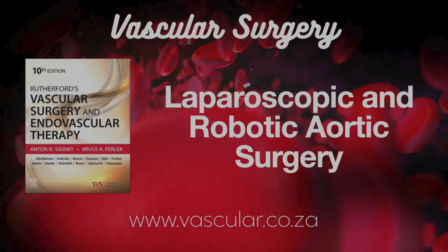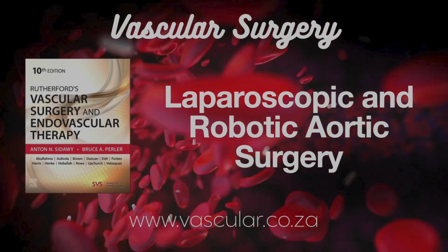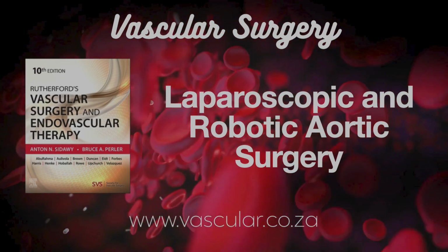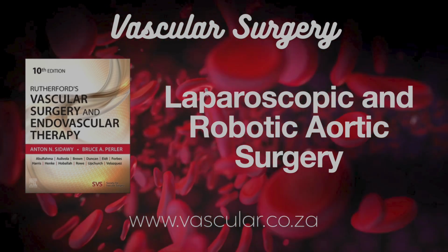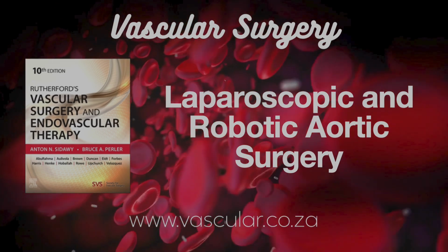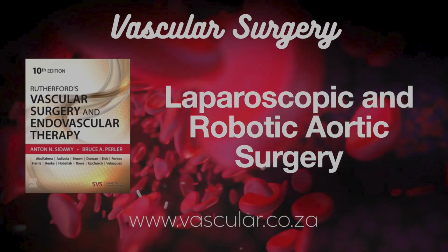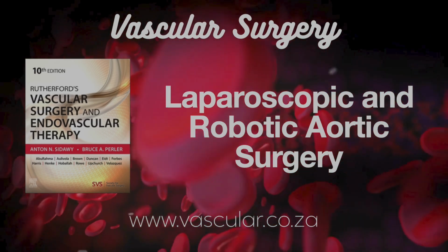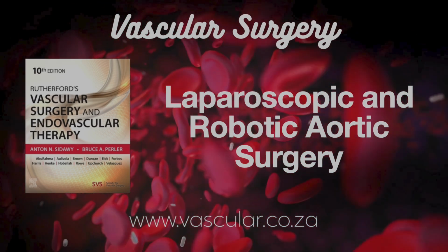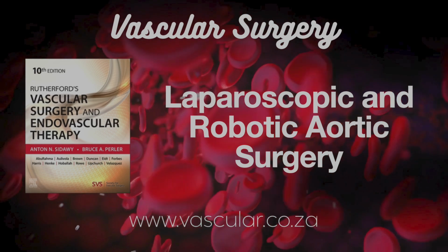Okay. What about converting? Having to switch from minimally invasive to a full open operation midstream, that must happen sometimes. It does, and it's a key thing to track. Conversion rates seemed higher for TLAS, around 8 or 9% maybe, compared to HALS or mini-lap assisted, which were lower, maybe 2 to 4%. And why would they need to convert? Common reasons were finding the aorta was really badly calcified, rock hard basically, or unexpected significant bleeding that was hard to control laparoscopically, or just the procedure taking way too long, raising safety concerns. Safety first. Makes sense. You bail out if needed.